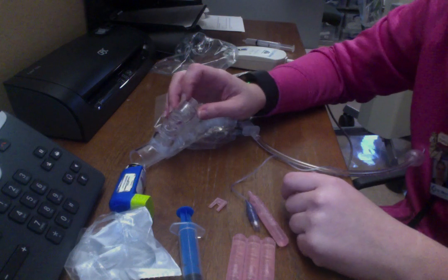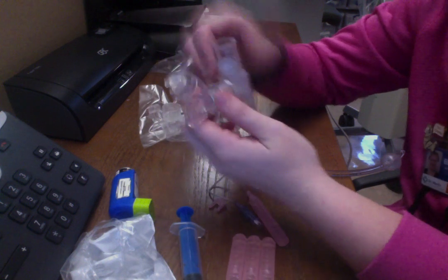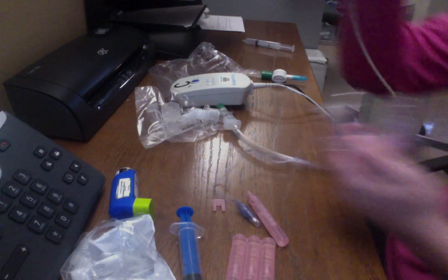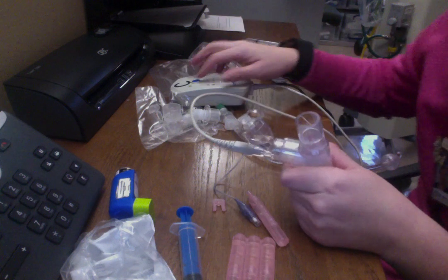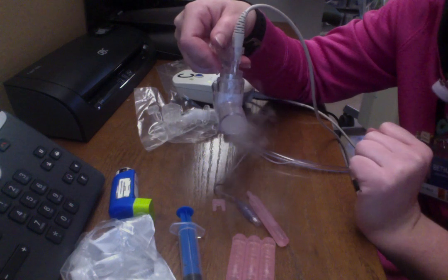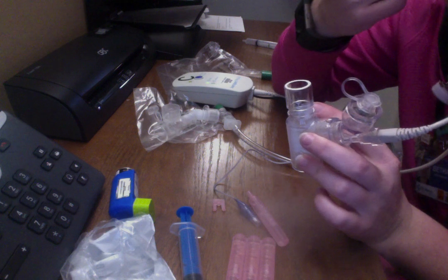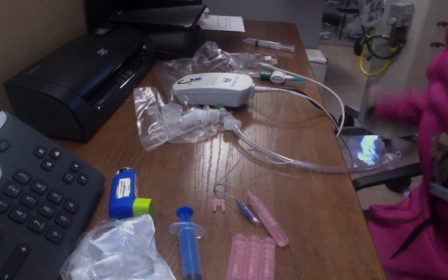The next thing I have is my inline aerosol. You have a little adapter that connects to your ventilator, and this piece is where you put in the medication, which just opens up like this. I have this thing called an aerogen. You connect the gray piece right in here, push the power, and you can see my medication coming out here. You want to make sure you don't leave your patient until this cup is completely empty, so that way you know your patient got all of the medication they needed. And that's it.